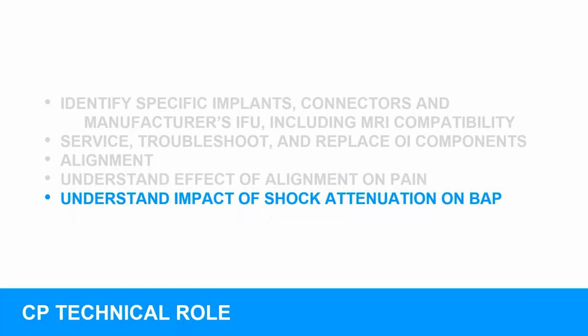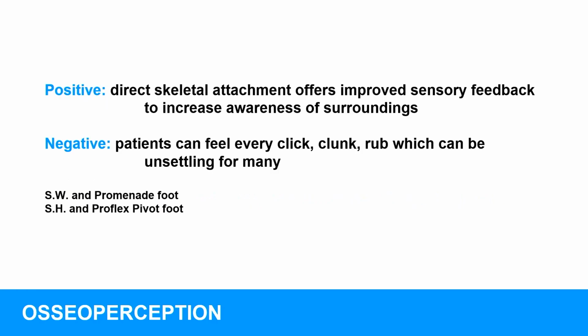Understand the impact of shock attenuation on bone-anchored prostheses. Osteoperception is absolutely wonderful. I keep hearing positive comments about it, but we're also seeing there are some negatives. Jeff came back from Australia and couldn't ride a bike on a gravel road for about 6 months. He went four-wheel driving with his girlfriend, and he actually said, "You drive, I'm taking my legs off." But that went away over time.